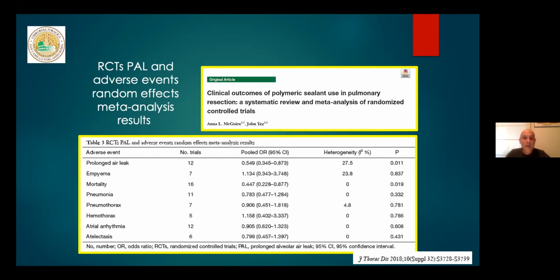data. And finally, the meta-analysis for adverse events, as you see, did not reveal an increase in probability, with a very low heterogeneity. So in conclusion, based on the data of literature, the value of topical agents is accepted, regardless of whether these agents actually contributed to local hemostasis and aerostasis or merely allow time for activating the tissue repair system of the patient.